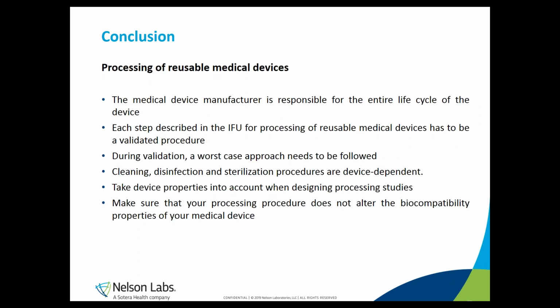A validation study should always reflect a worst-case situation. Device design and properties determine the procedures that are used for cleaning, for disinfection and sterilization, and should be taken into account when designing processing studies. And be aware that whenever you are using chemicals during processing of a device, these may cause alterations in the biocompatibility of your device. Therefore, cytotoxicity testing is used as a screening marker to assess any potential problems with biocompatibility, especially for those devices that do come into direct contact with the patient.